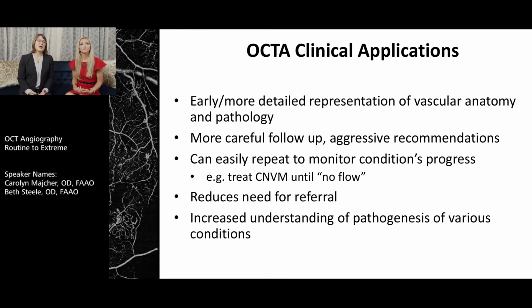So we're going to be looking at things that we aren't necessarily able to detect clinically. And this type of information can change the way we care for our patient. It can lead to a more aggressive follow-up schedule. It can lead to different patient education. It can lead to different referrals.